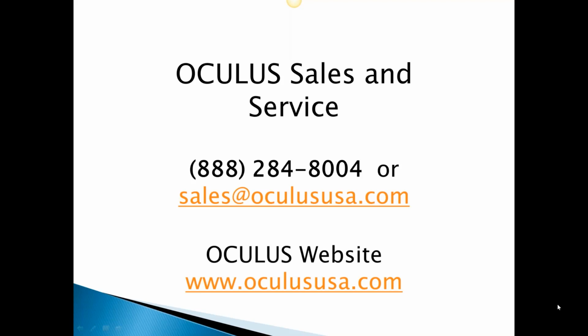You may be looking at a chord of 15 millimeters, toricity that is at 180 and 90, and you get out to 17 or even 18 millimeters, and you might be dealing with toricity at 30 degrees and 120 degrees. Now, optically, obviously, that's no big deal, but in terms of fitting, that's an enormously big deal, because where are you putting your toric flange?